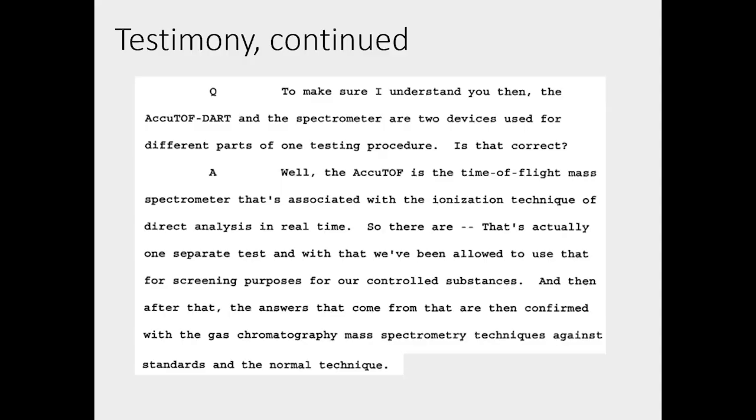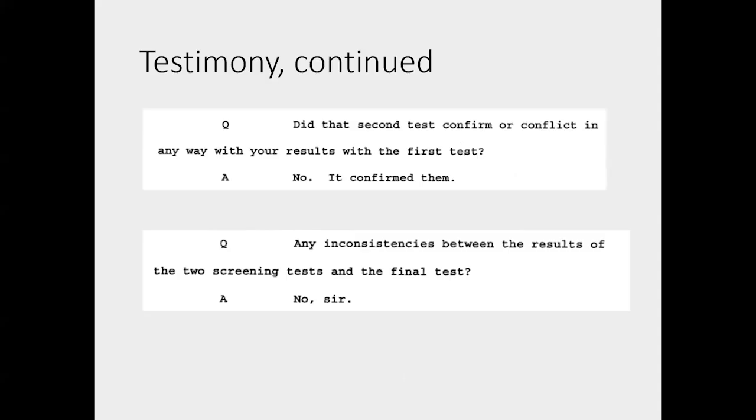So again, just taking it back to what's the important information, and that's that we're using this for screening. And as they continued, did that second test confirm or conflict? And it said it confirms them. And were there any inconsistencies? So again, that was the first time that we had testimony regarding DART TOF in our state. And even though he started to go into the more technical side, it really didn't get above anything more than just ionization. At the end of the day, the most important thing was this is a screening technique, and we then confirmed the results with another test.